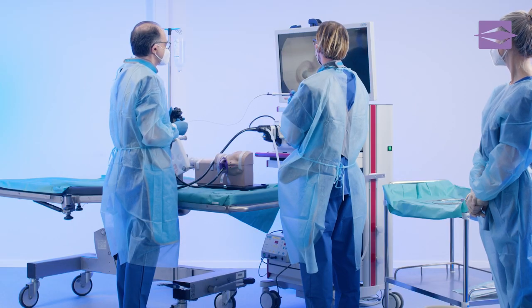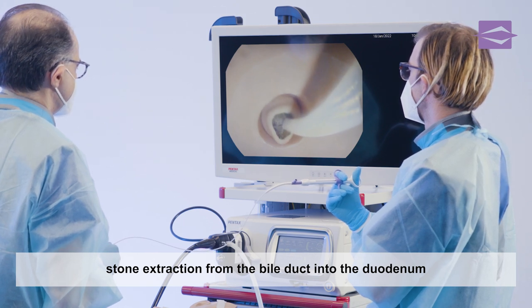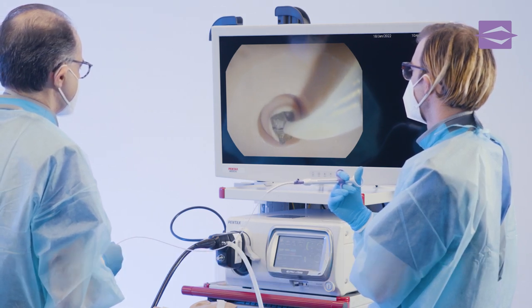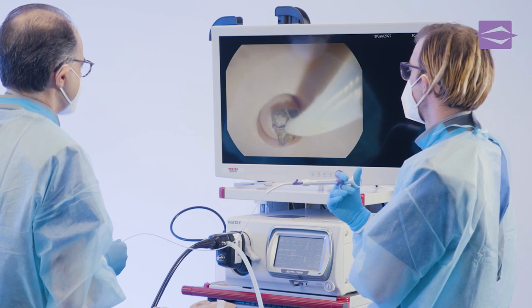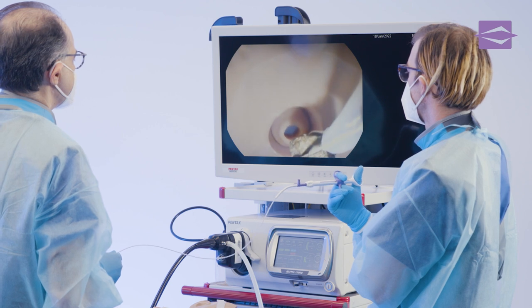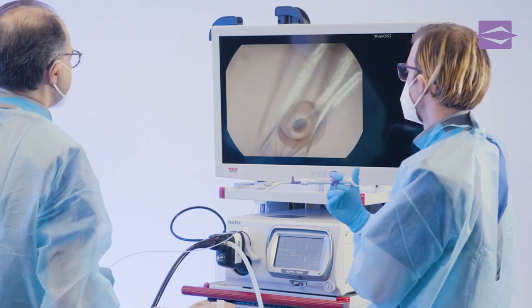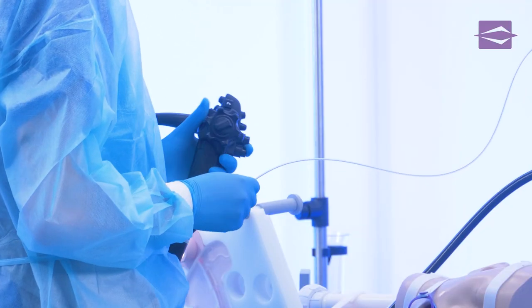The stone is extracted by the examiner, who slowly pulls the stone extraction basket through the papilla into the duodenum, while the assistant fixes the stone in the basket by pulling the handle tight. The extracted gallstone can now be released from the basket into the duodenum, and the basket is retracted again into the tube.